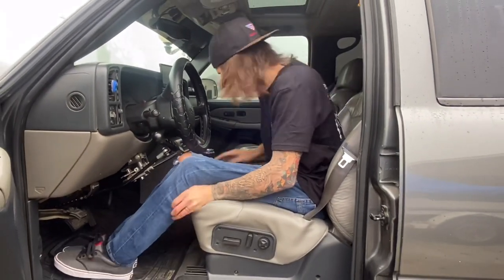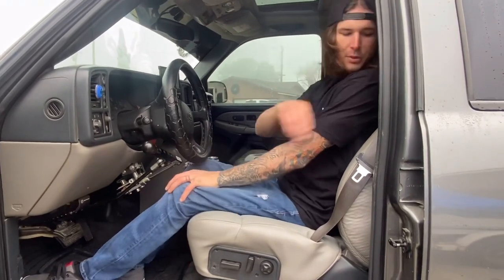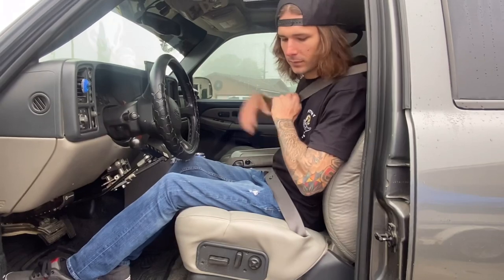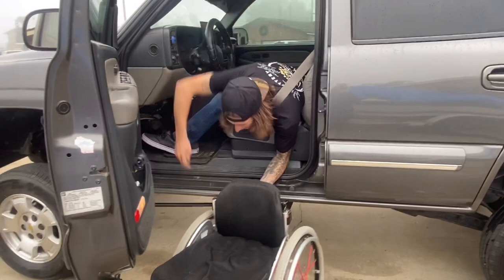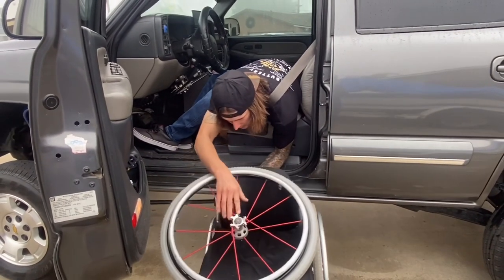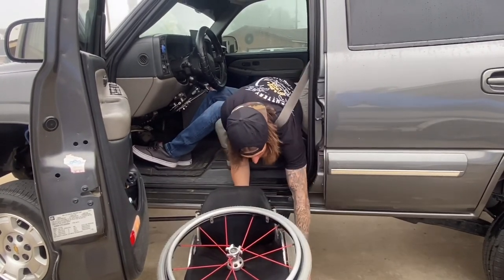Right up in. From here you're going to want to get all the way in and put your seatbelt on. Then grab your wheelchair — I like to put my wheels on top of the chair so I can get them both ready to put into the cab.